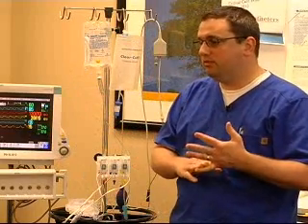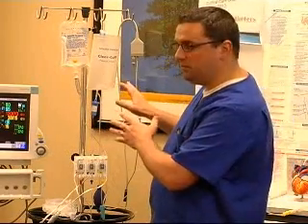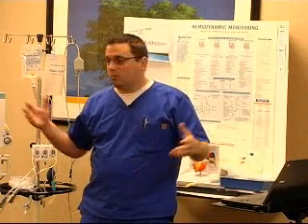So once the balloon's up and you've communicated that to the practitioner, they're going to be watching that PA tracing, and you can see this is an example. This is a really condensed sample. You can see your CVP tracing on your PA line, which is in your right atrium and shows the placement there. Once you drop through the valve into the right ventricle, it's going to change dramatically. You're going to see that big RV waveform, which is much more dramatic. You've got to think how much movement's actually happening in the ventricle. That's why you're seeing a lot larger pressure tracing.